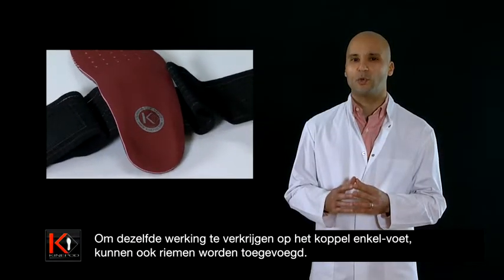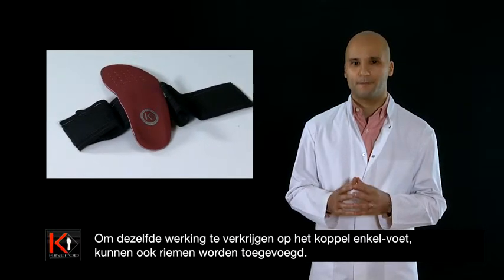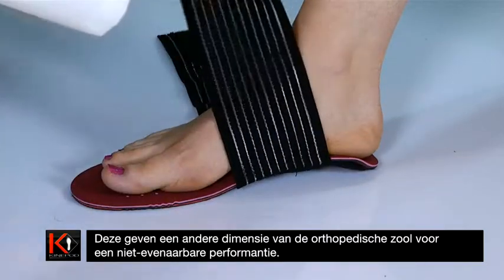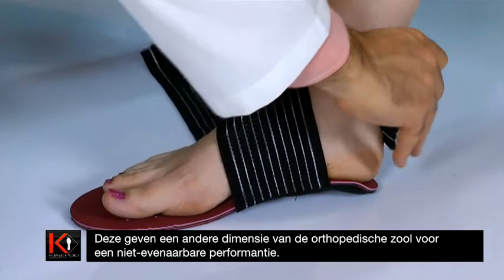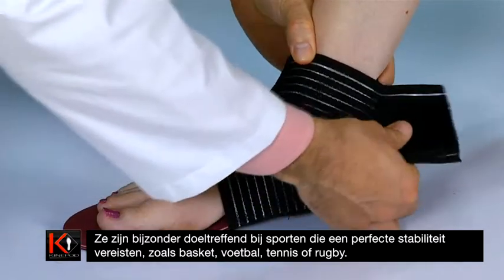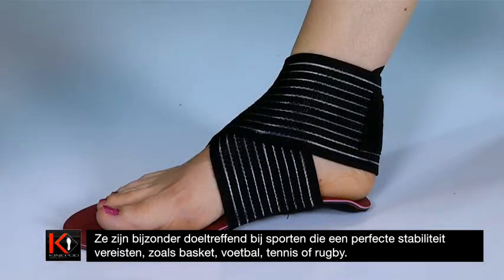Also, in order to achieve the same action on the coupled ankle plus foot, straps can be added. These give another dimension to the orthopedic sole, thereby ensuring incomparable performance. They are particularly efficient in sports that demand perfect stability, such as basketball, football, tennis, or rugby.